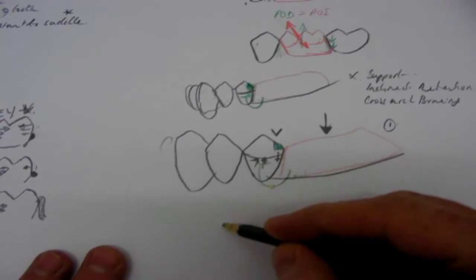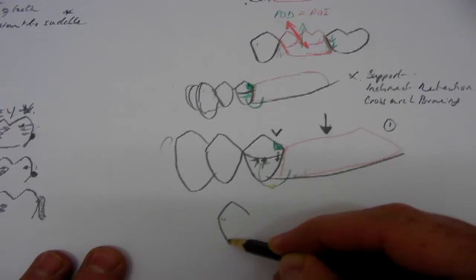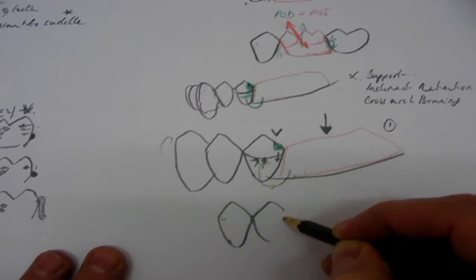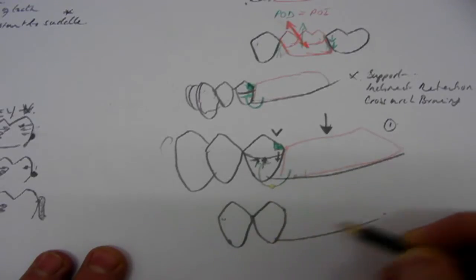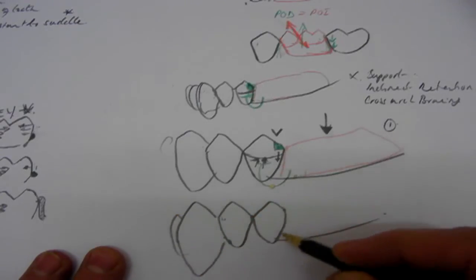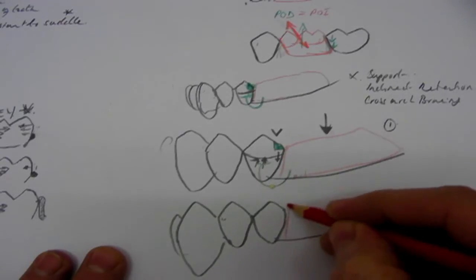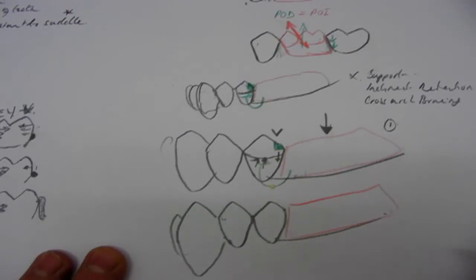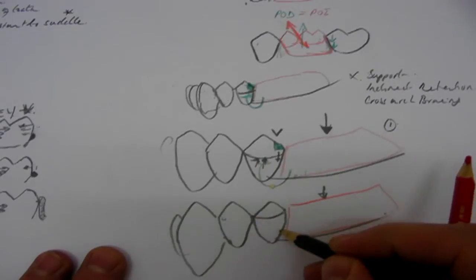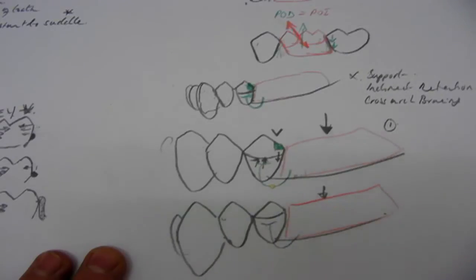So a better design is to, let's draw this again, move the occlusal rest further forward or distant to the saddle area, or the opposite side of the clasp tip, whichever way you want to word it. Slightly large canine there, never mind. So same scenario, we've got a saddle area here, putting load down onto the saddle area, and we've got our survey line and our clasp tip in there, gingerly approaching clasp.